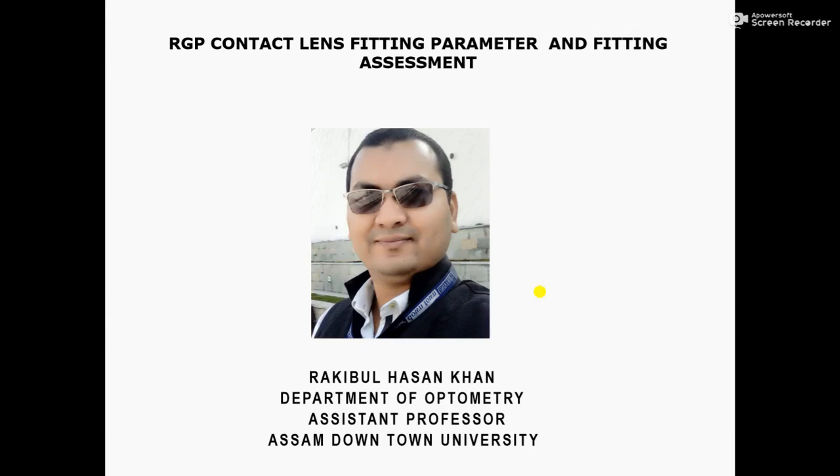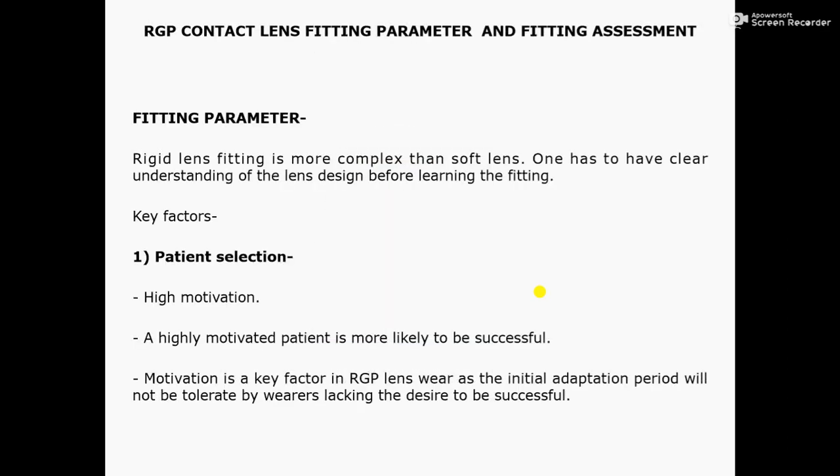Today I am going to discuss RGP contact lens fitting parameters and fitting assessment. Fitting parameter.